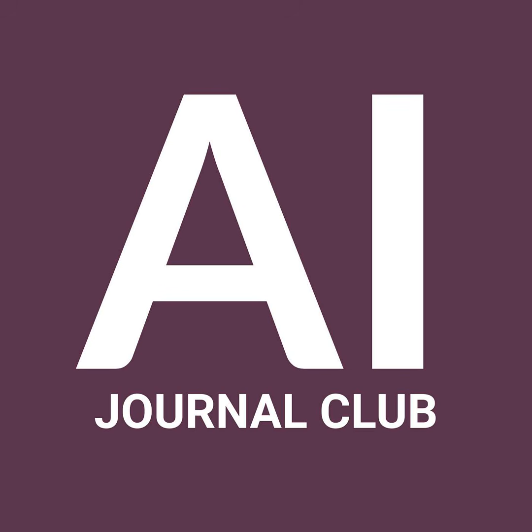They are intentionally blinding the algorithm to the microenvironment and just asking it to diagnose based purely on the macroenvironment. And to understand why they would even attempt this, we really have to talk about the massive silent bottleneck in digital pathology right now, which is compute power. Oh, yeah. The elephant in the room. Seriously. High-resolution whole slide images are absolute data behemoths. Scanning, storing, running AI inference on 40x images requires massive server racks. Incredibly expensive GPUs, too. Right. And network bandwidth that, frankly, most community hospitals simply do not have.